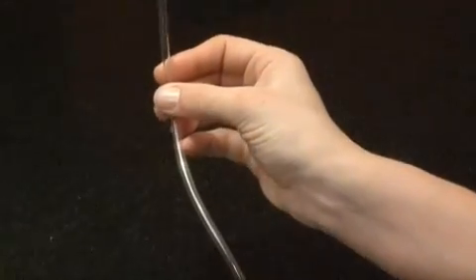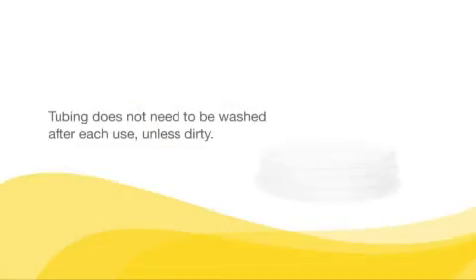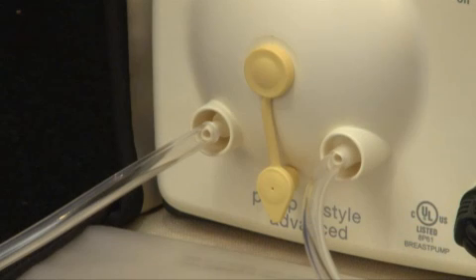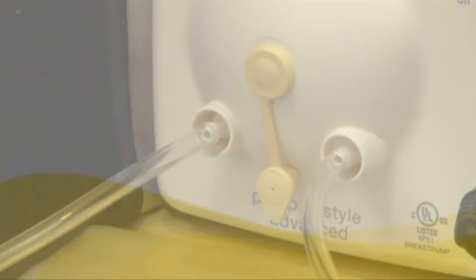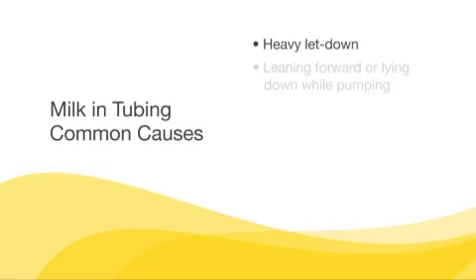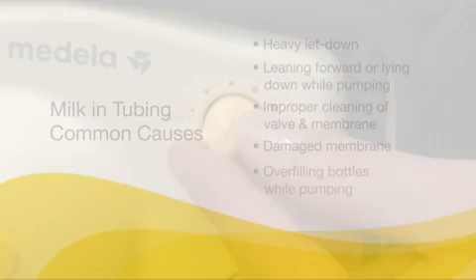Inspect tubing after each use for condensation or milk. Unless dirty, tubing does not need to be washed after each use. To eliminate condensation after you have finished pumping, continue running the pump with tubing attached for another 1 to 2 minutes or until dry. Milk in tubing common causes: heavy letdown, leaning forward or lying down while pumping, improper cleaning of valve and membrane, damaged membrane, overfilling bottles while pumping.